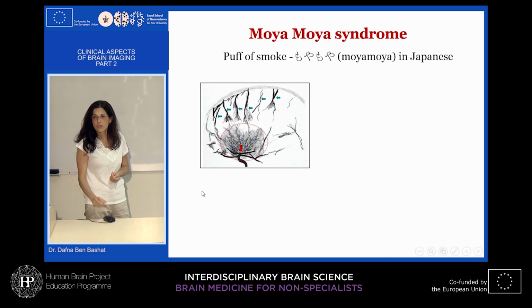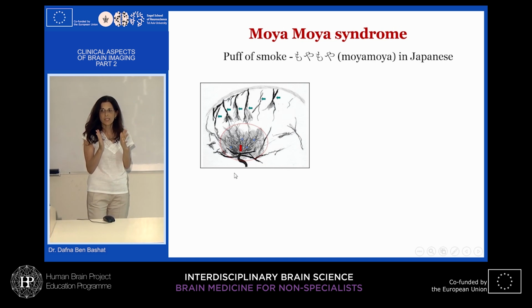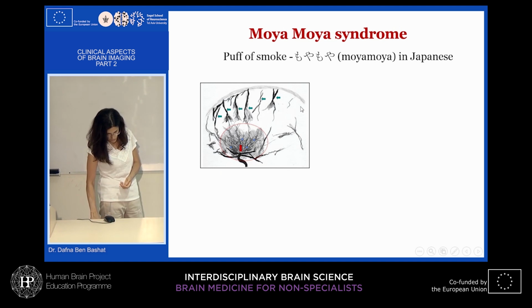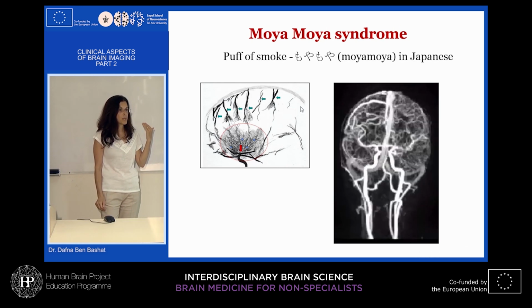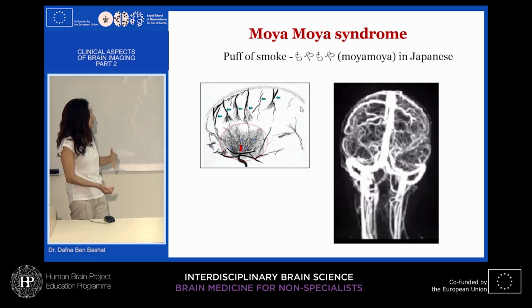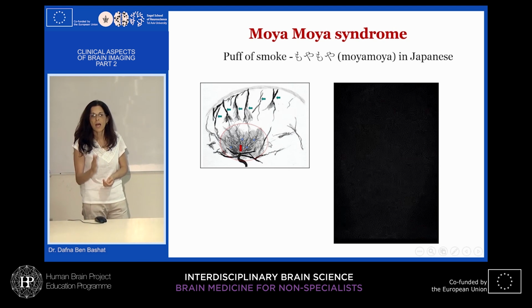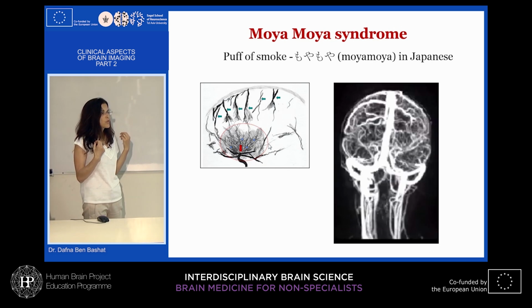But often they do get strokes because those are very narrow blood vessels. Over time, because it's a blood vessel disorder, and the blood vessels are affected all the time, they can get a lot of strokes, and there is always a question of surgery. So what's being done clinically, they look at the dynamic process. I said at the beginning, one important thing in MRI is looking at dynamic processes. So they inject gadolinium and look dynamically. Again, just visually, they assess how long it takes for the gadolinium to reach the collateral circulation. It's very slow, delayed in time. Again, they don't quantify things.